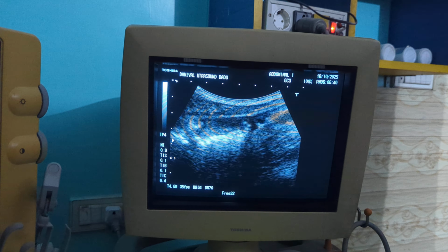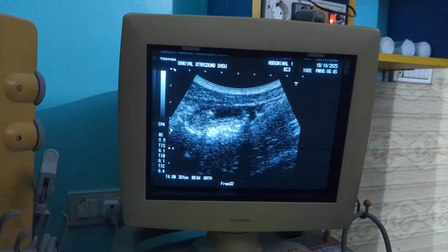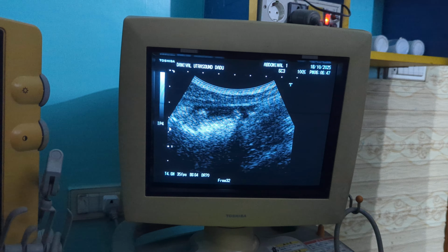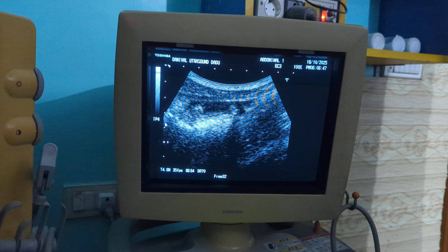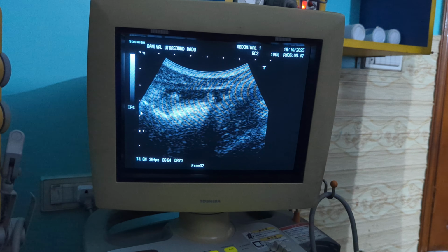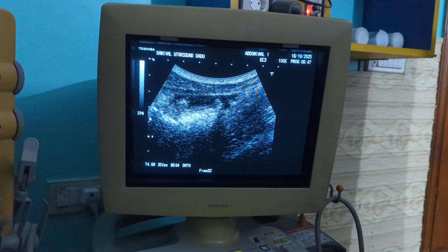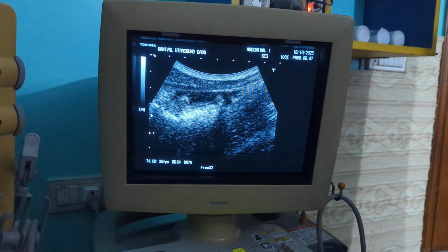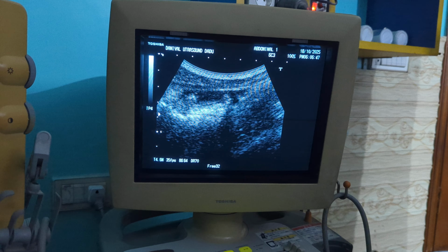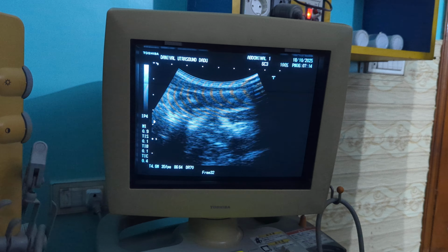Now, actually, one more thing I would like to share here, that why these fecoliths are important, why they matter. Actually, the presence of fecoliths is very significant because it is a primary cause of obstruction in most cases of appendicitis. In both proximal and distal parts, they are both blocked. The trapped secretions cannot escape. This increases pressure and may eventually cause perforation if it remains untreated. So, the timely diagnosis is crucial.